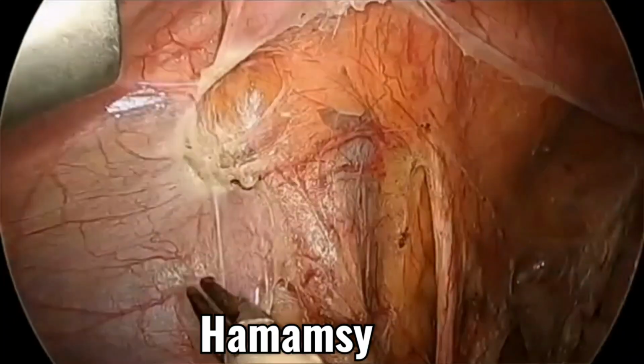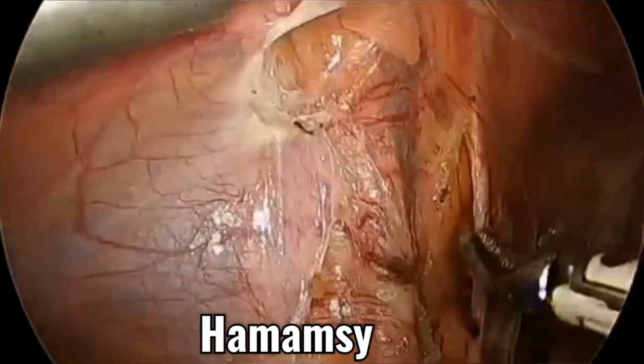The fatty tissue is your friend from above downward.